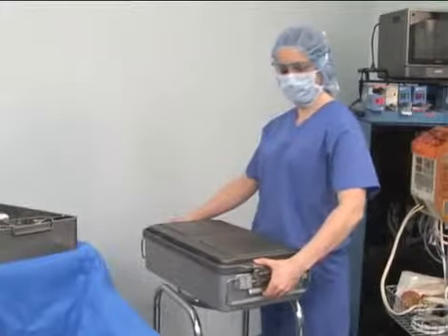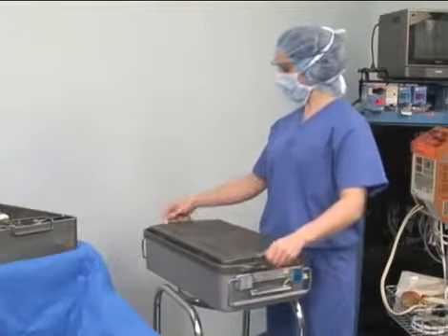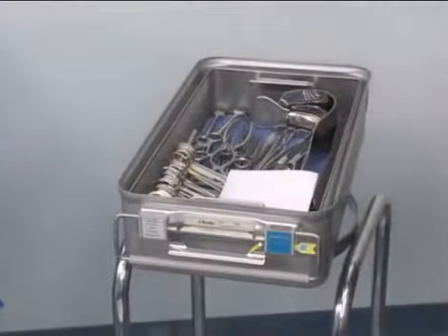Do not stack heavy sterile instruments precariously high or in such a way that they might be dropped. Avoid holding a heavy instrument tray in one hand and removing the wrapper with the other. This puts excessive strain on the wrist and you may drop the tray. Put the tray on a non-sterile table before opening the wrapper.